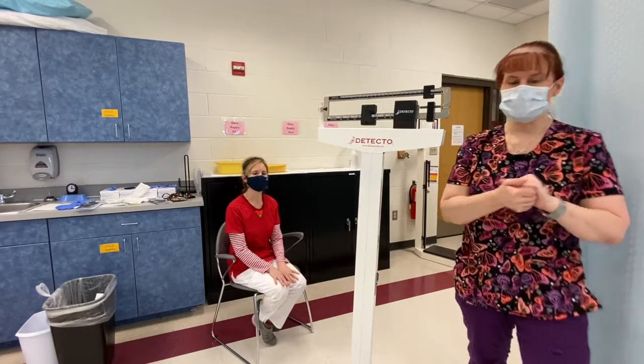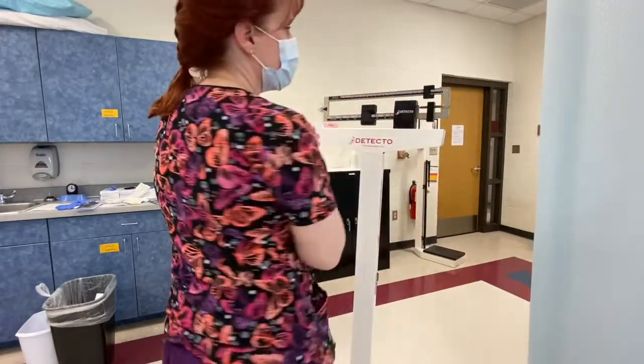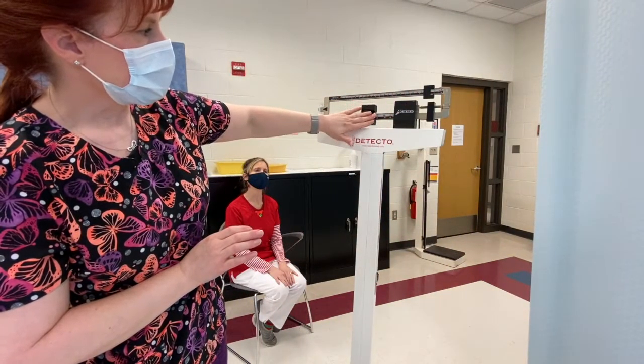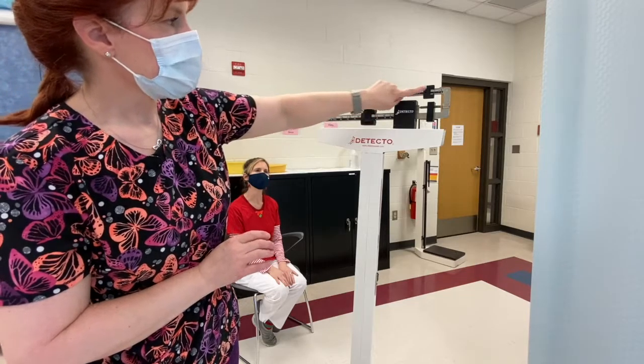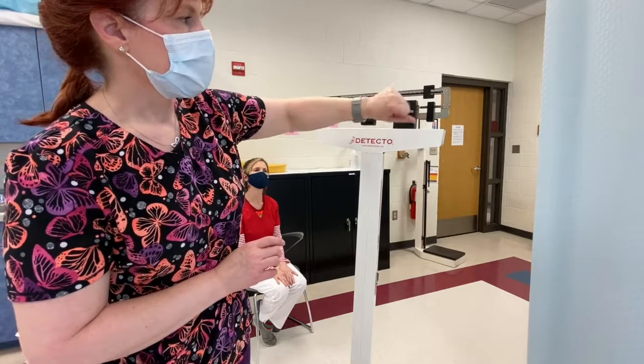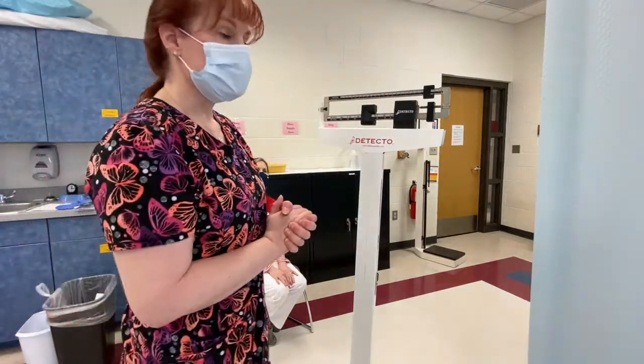I'm going to wash my hands, and I'm going to check my scale and make sure that I get my weight correctly. The bottom number indicator is at a number, and the top number indicator is at a number.